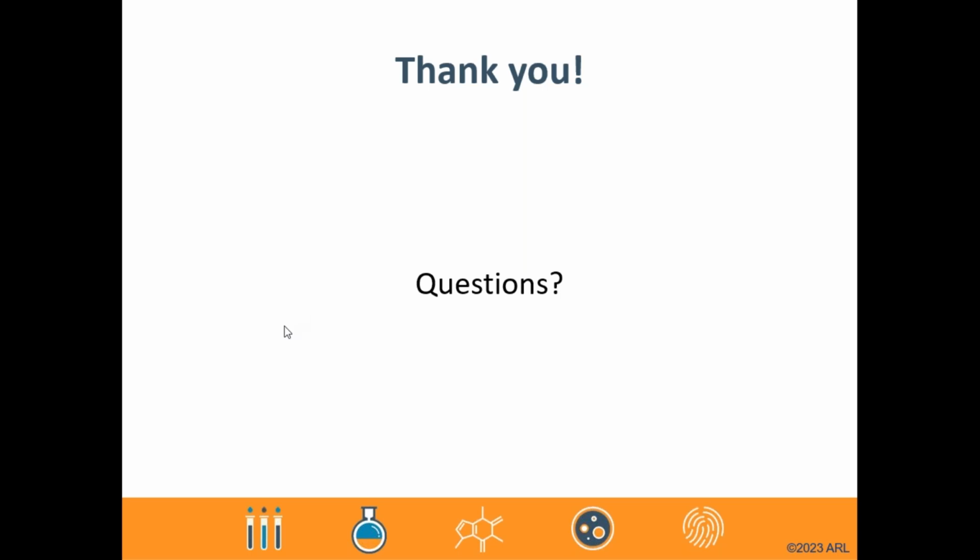Here's one that says, how do you determine which testing method works best? My question is because we know that different organisms may be easily found using one particular method versus another one. And really that's going to go to the risk-based decision you need to make in determining which method you employ, whether, again, it's at your facility or a contract testing lab.